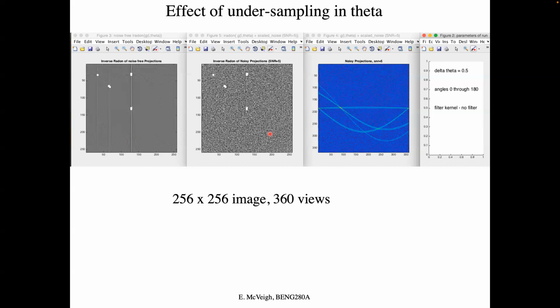Well, the ones one beside the other will look remarkably similar, right? That's true. And so they're kind of redundant after a while, particularly if your projections, say I have 1,000 detectors, right? And when I take 10,000 views, my detector actually moves 1/100th of a detector distance. Is that really any different than where it was, right? So there's that.